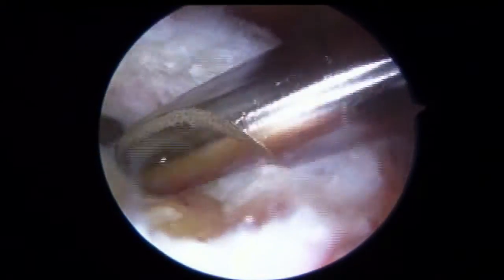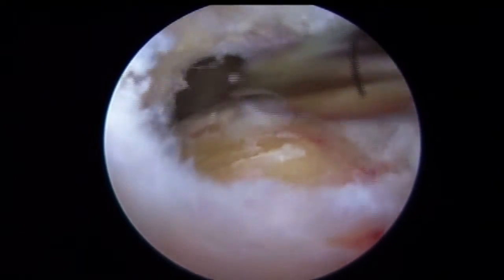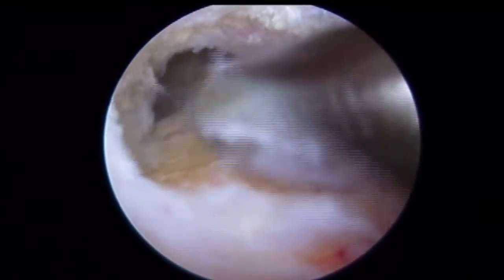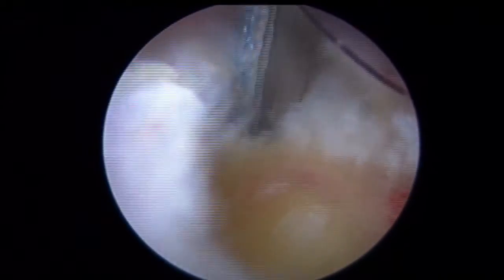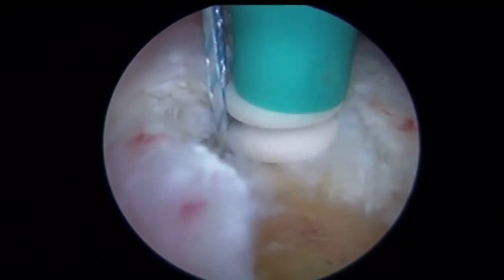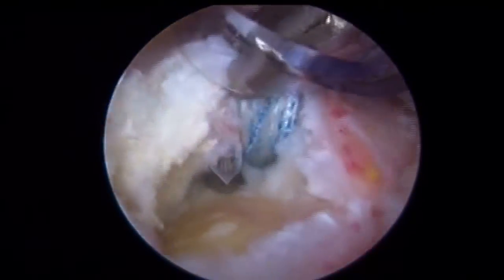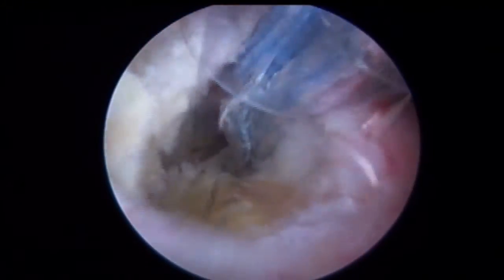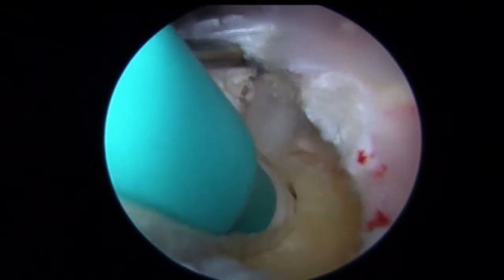With the arthroscope in the posterolateral portal, the supraspinatus footprint is debrided and lightly decorticated using a bone cutting shaver to create a bleeding bone surface amenable for healing of the tendon. The tendon edges are debrided of any irregular tissue, and the cuff is mobilized and approximated to the repair site. A knotless anchor, loaded with suture tape, is placed along the anterior aspect of the footprint, 1 to 2 millimeters lateral to the articular margin. The anchor is inserted and advanced flush to bone. A suture shuttling device is used to pass both limbs of the suture tape through the tendon, approximately 1 to 1 and a half centimeters medial to the free edge of the tendon. A second posterior anchor is placed in a similar fashion, approximately 1 and a half centimeters posterior to the first anchor.